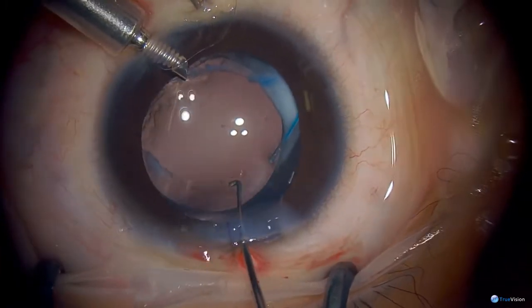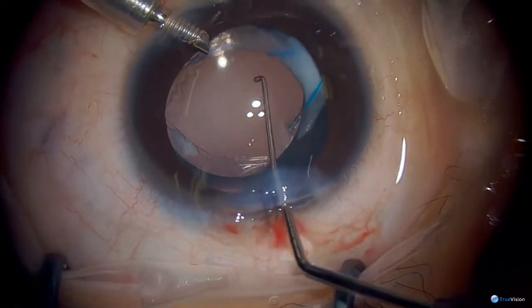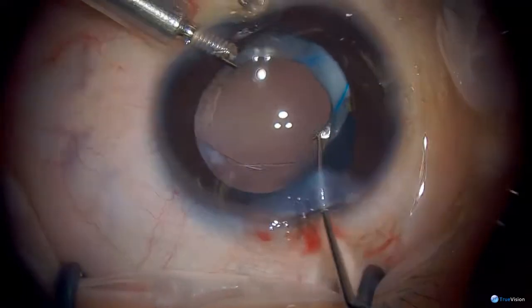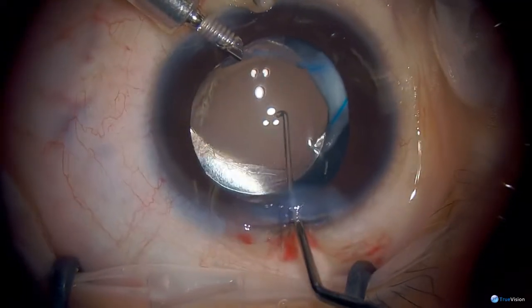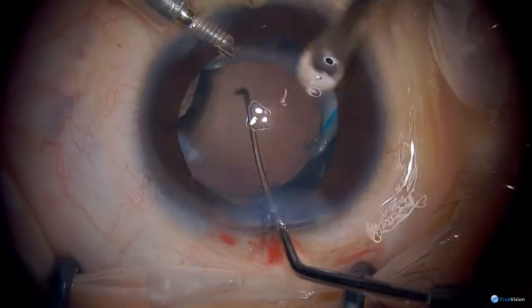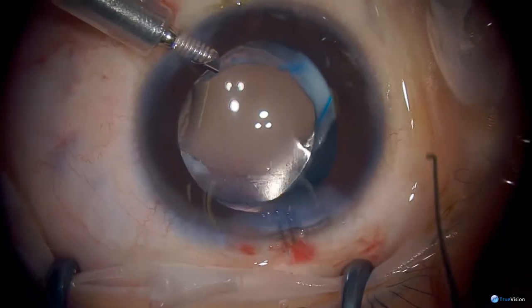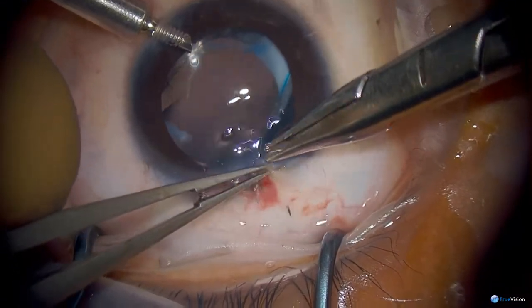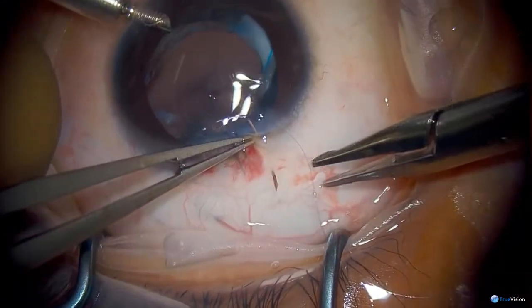So this goes just tucking one side in, okay. And then we're just going to push the lens, and there's the other side. Okay, so the lens is in the sulcus right now. It's a little bit decentered, but I don't want to cut this too much. Capsule will tear, so I think it's in good position. And it's nicely captured there, so it won't move anymore.